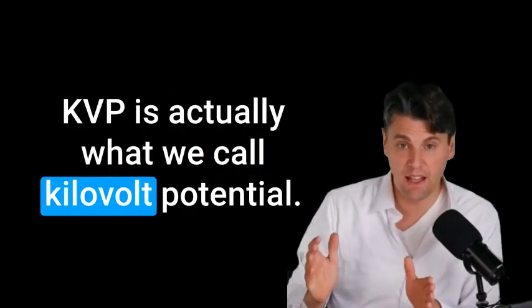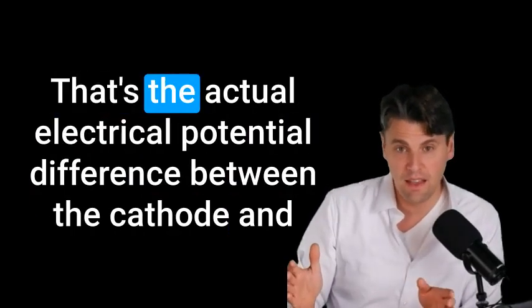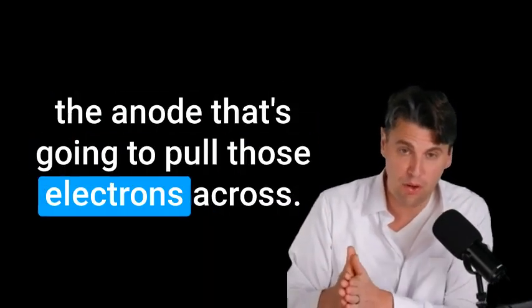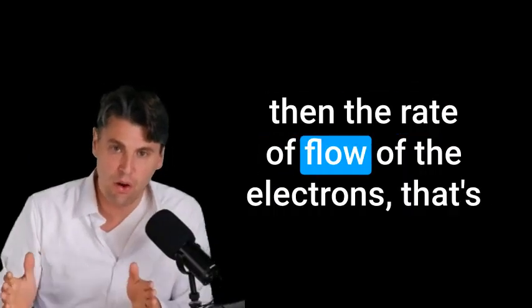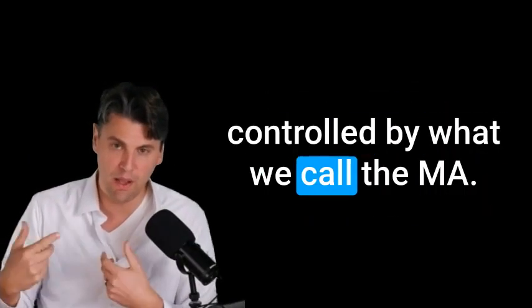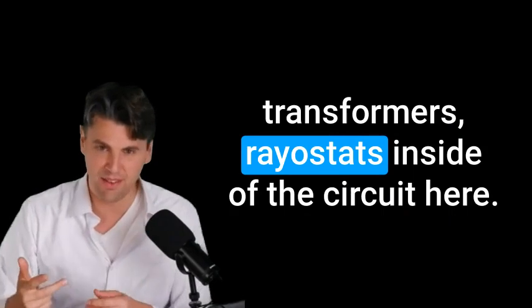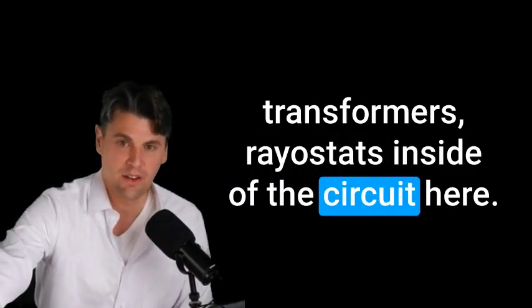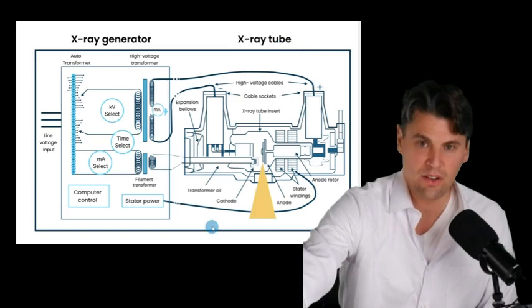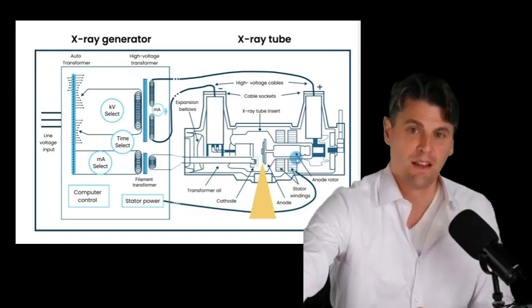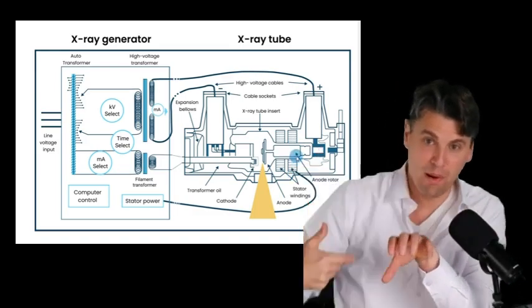So this is the first time I've talked about KVP and MA. KVP is actually what we call kilovolt potential. That's the actual electrical potential difference between the cathode and the anode that's going to pull those electrons across. And the rate of flow of the electrons, that's controlled by what we call the MA. See our video for more details about all the fun transformers, rheostats inside of the circuit here. And then this is just like we talked about, electrons coming from the cathode, hitting the target, and then out come our x-rays. And that is on a rotating anode, which is rotating because we have a rotor that's getting pulled by the stator.